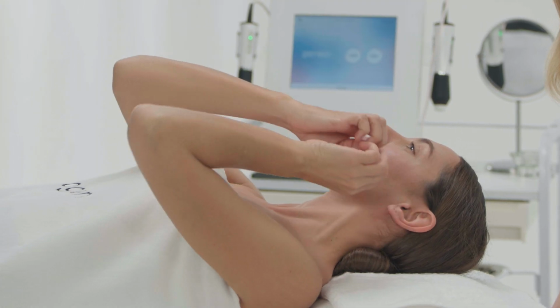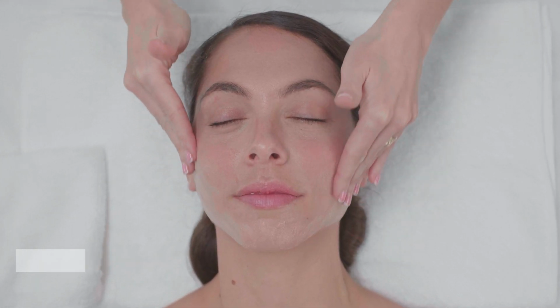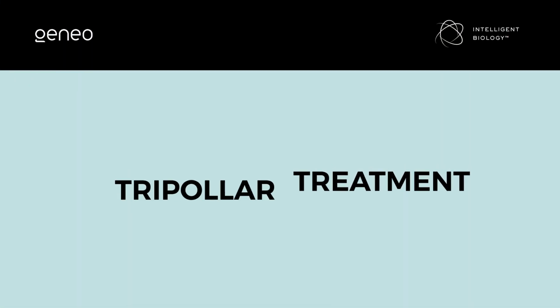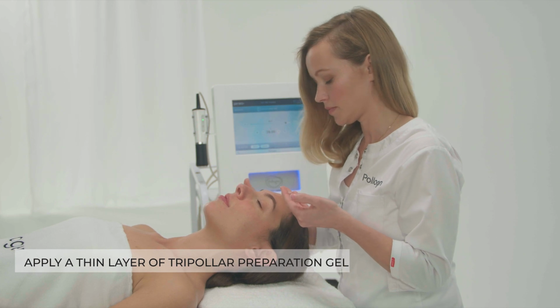Remove jewelry and piercing. Clean with soap and water. Dry completely after cleaning. Apply a thin layer of TRIPOLLAR preparation gel.